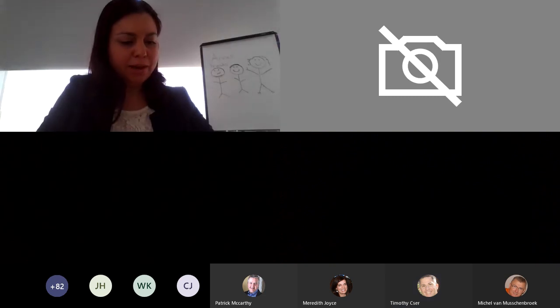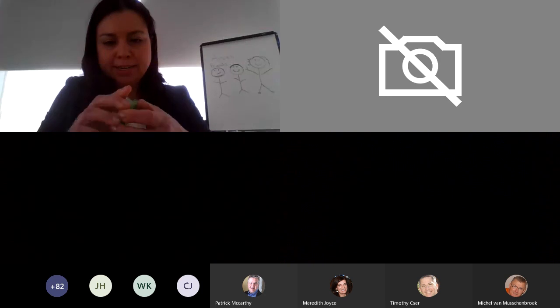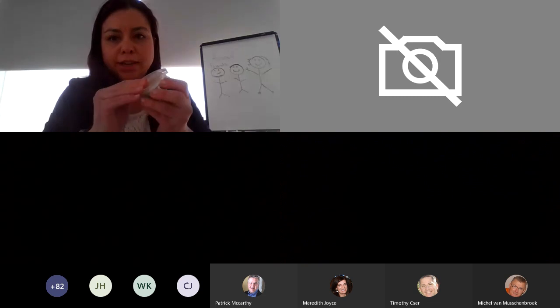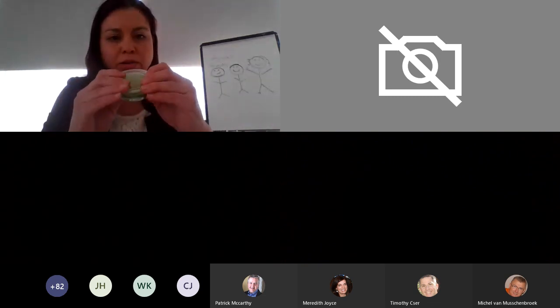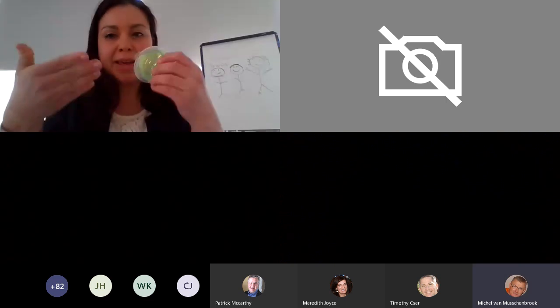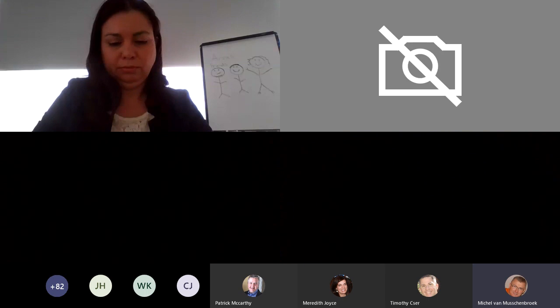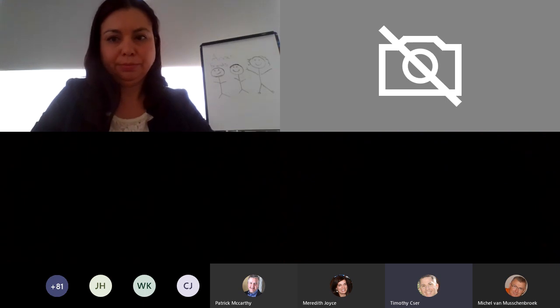Is there a little space on the media? There is just enough space, but using the hinge lid from a funnel gives you a little bit more head space. That's how we would recommend to do growth promotion — use that lid that you would normally use in a test.